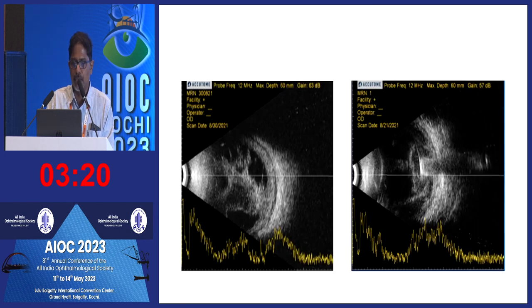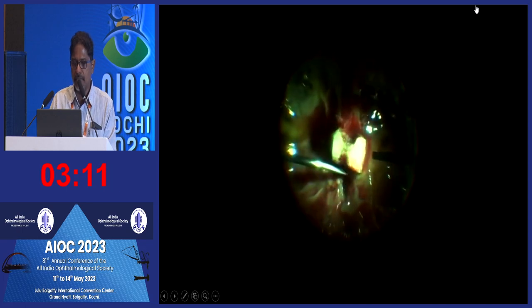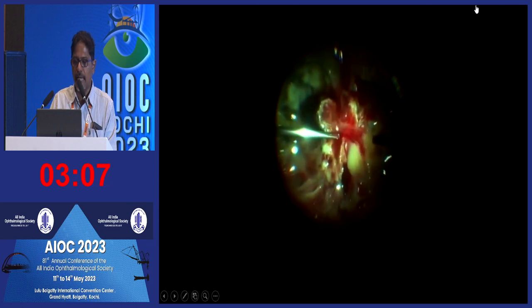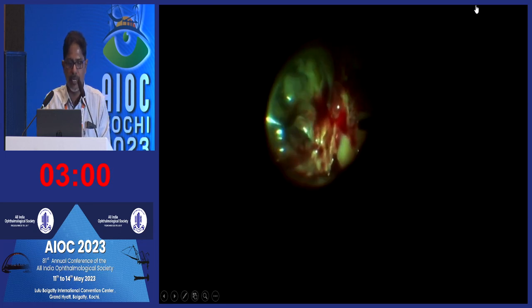So finally we decided to go on, even though the media was very hazy. We thought we'd make a try to go in and remove this. After I removed all the superficial exudates, there was a lot of bleeding inside, so I put in air. Then only was I able to identify it was actually an air gun pellet. He was not really aware how he got injured because he was drunk at that period of time.